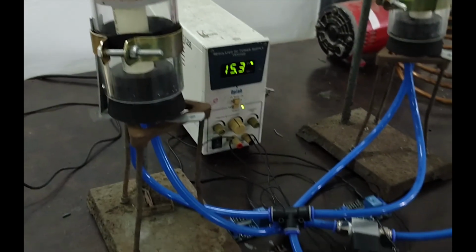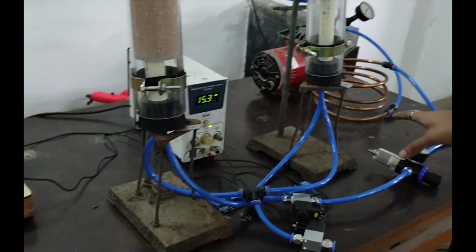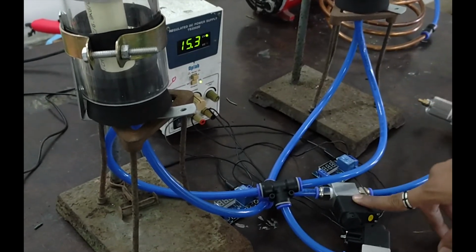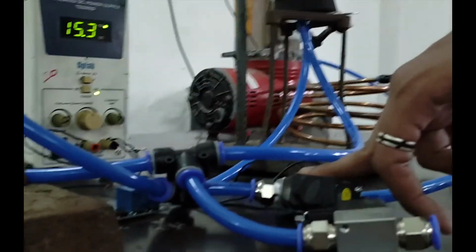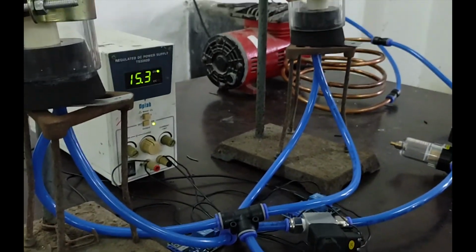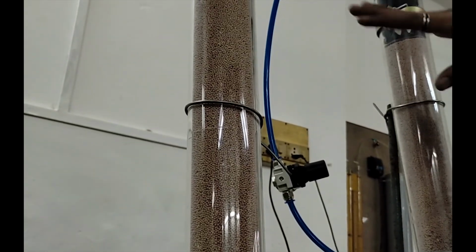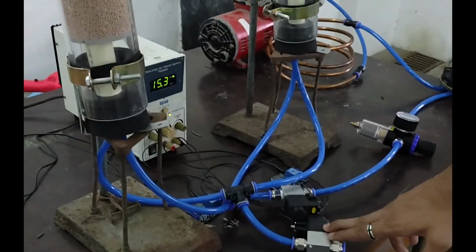After that we have done a synchronization cycle between both of them. At the initial stage, the inlet air is supplied to both of them for 1 minute, and after that this exhaust solenoid valve starts, and for 30 seconds the exhaust happens. This is because the zeolite traps the nitrogen gas in it, and after a few seconds the nitrogen gas which is absorbed by the zeolite material is then taken out through the exhaust solenoid valve.